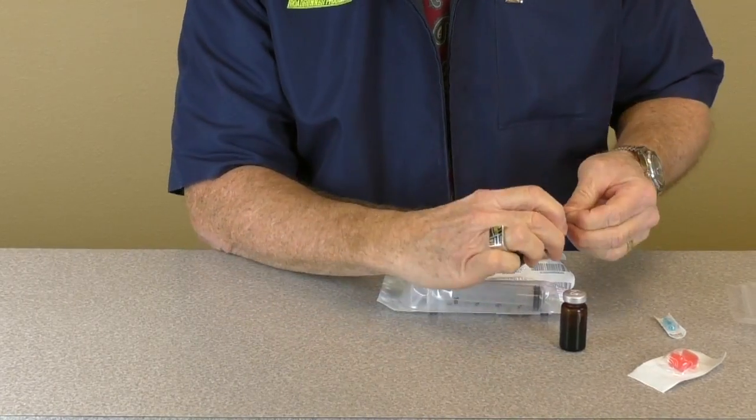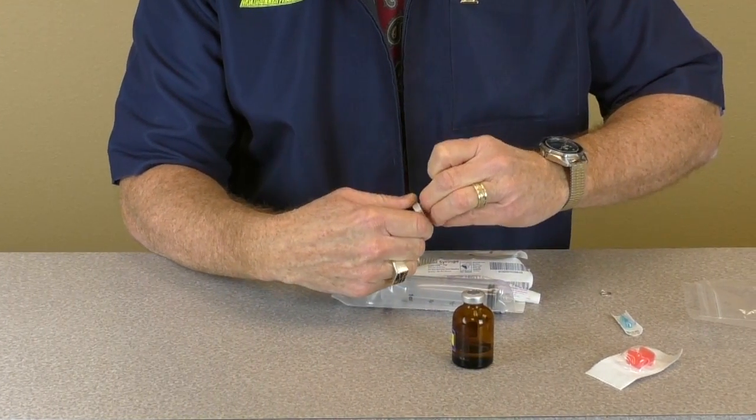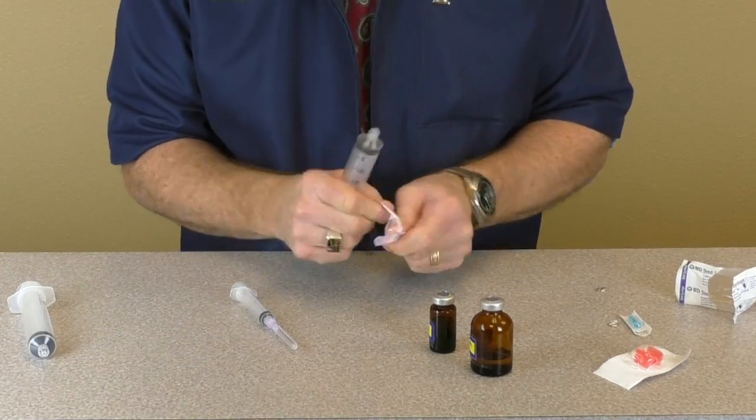Begin by removing the caps from the injectable vials and swab the rubber stoppers with an alcohol pad. Unwrap all the syringes and attach needles to one large one and one small one.